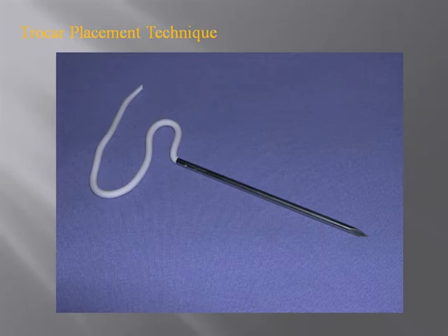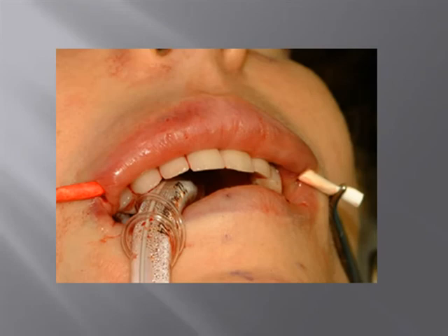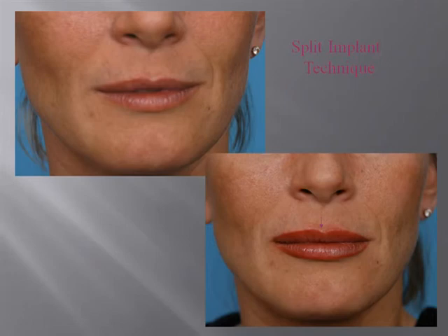The key to its placement is that of the trocar, or long needle. This makes it easier to pass through the lips or the nasal areas. For the lip area, for example, a simple incision is made in the corner and the trocar is passed. The implant is then spread out and the ends are simply trimmed and closed. The same technique is done for the nasolabial folds with a small incision at the base or the side of the nose and then down at the bottom, deepest part of the crease.